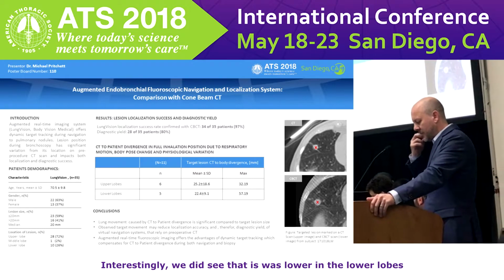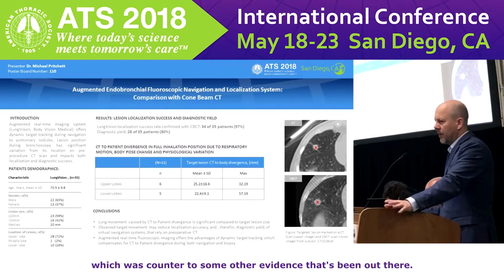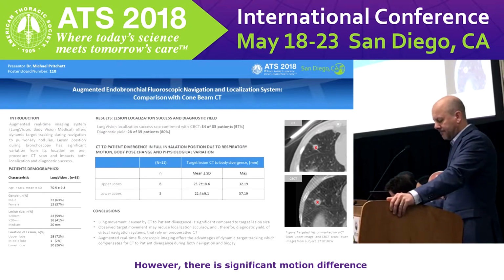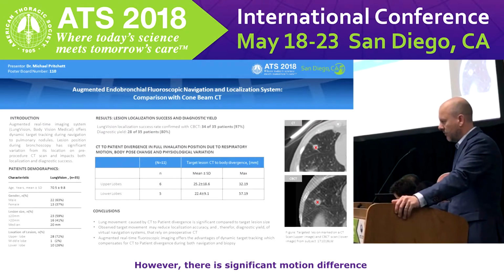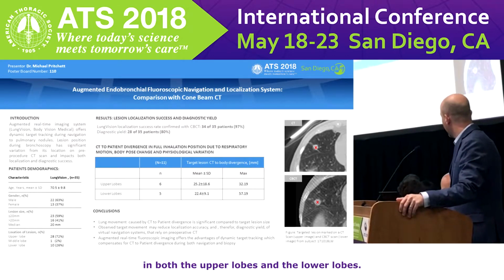Interestingly, we did see that this was lower in the lower lobes, which is counter to some other evidence that's been out there, so we're a little surprised at that. However, there's significant motion difference in both the upper lobes and the lower lobes.